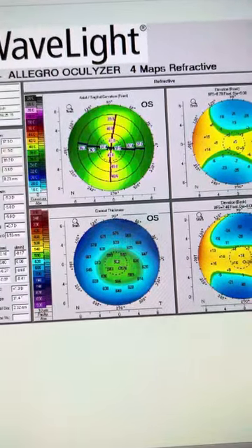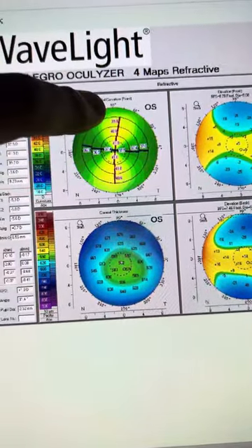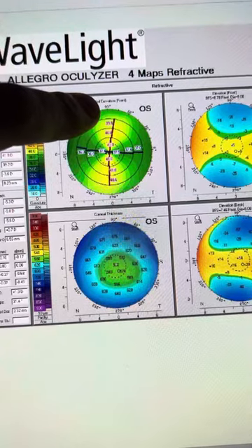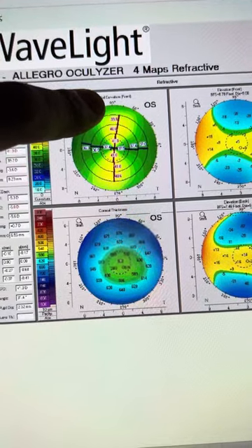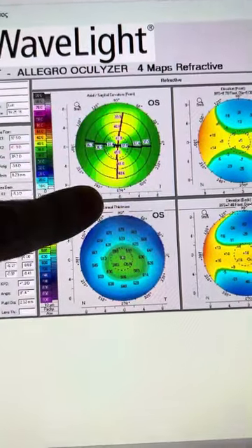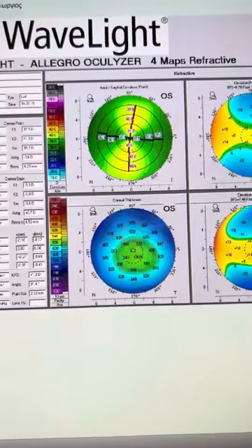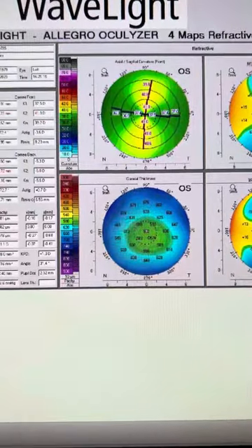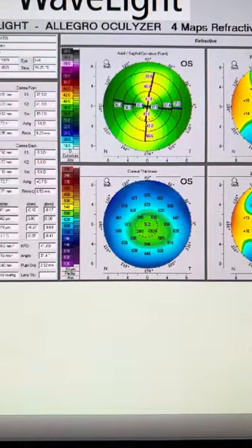Thus in power, the cornea as a lens is much stronger on this meridian. Therefore, the very strong with-the-rule astigmatism.